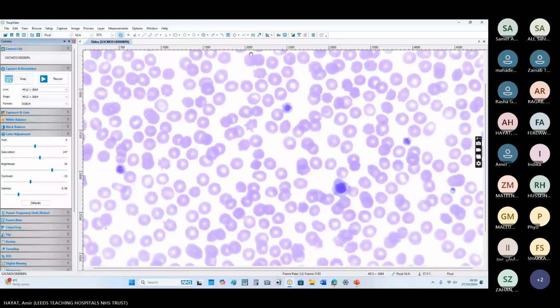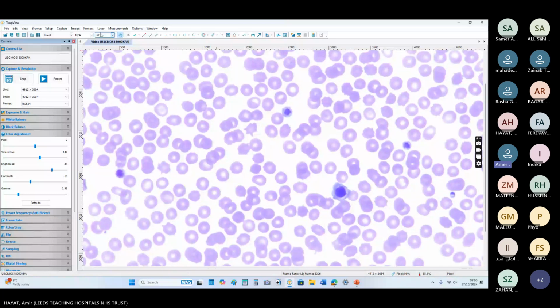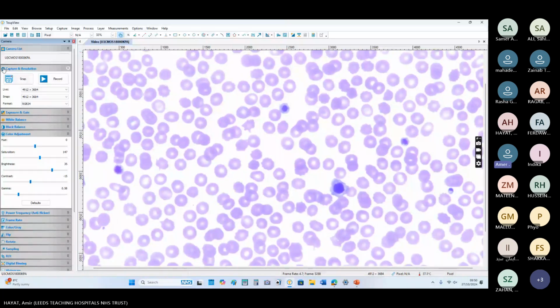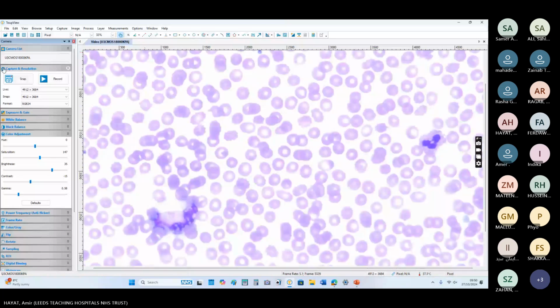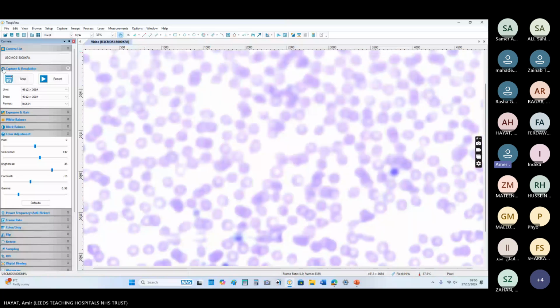So if you are working in a pediatric department, you will see many such cases of macrothrombocytopenia. You can see this platelet, it is bigger than the size of the RBC even. It's quite big. It is almost like an RBC. So macrothrombocytopenia usually comes in short cases, or they come in the coagulation paper, where they will give you an LTA, light transmission aggregometry graph, and a scenario, and they will ask you for the management of this patient.